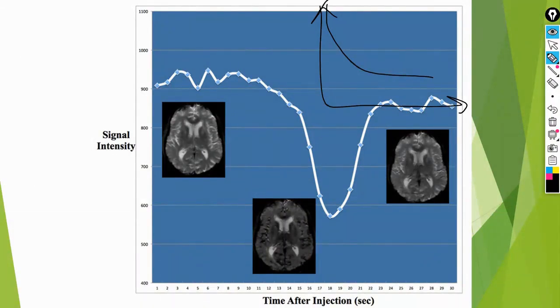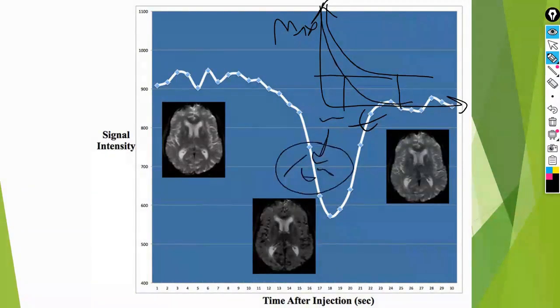So what does it mean to reduce it? It means it will drop quickly to 37% of its value. It used to take time to reach 37%, but now it will drop faster. This time will be shortened. So this is T2, right? Therefore, I have essentially reduced it.